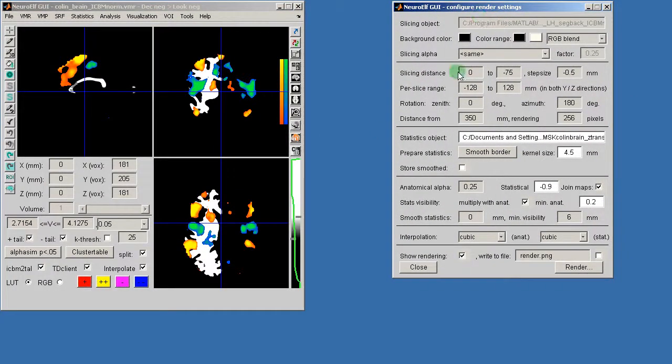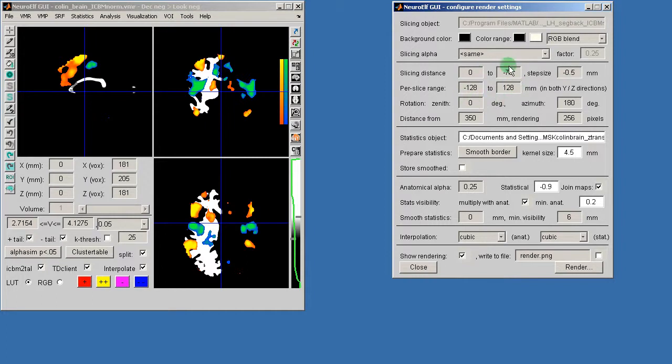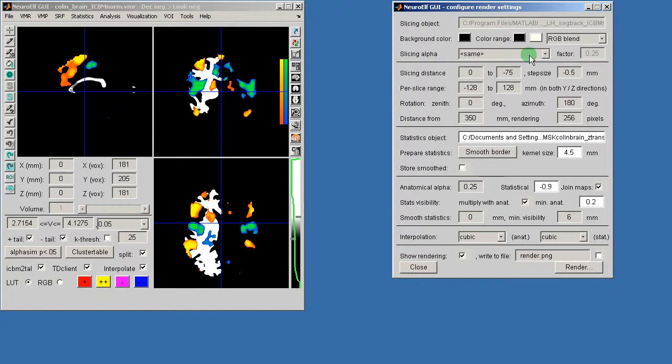You have then some options for additional objects that you want to use for the transparency information. And you can then also play around with the statistics, for instance by smoothing the border.